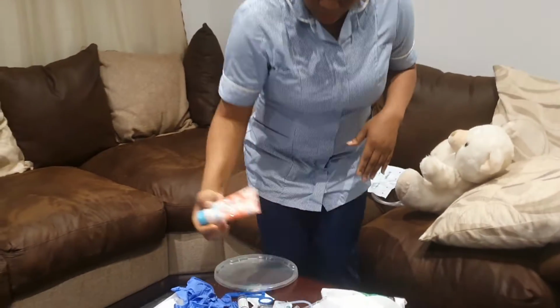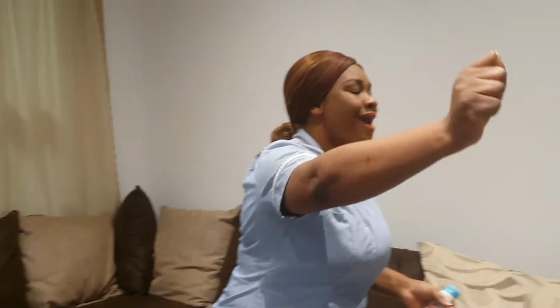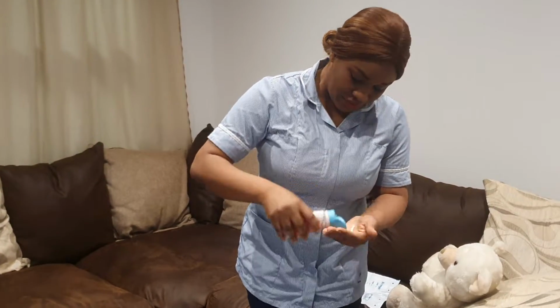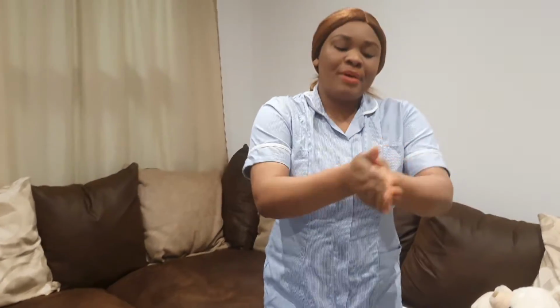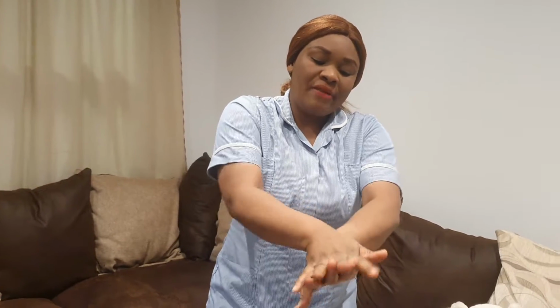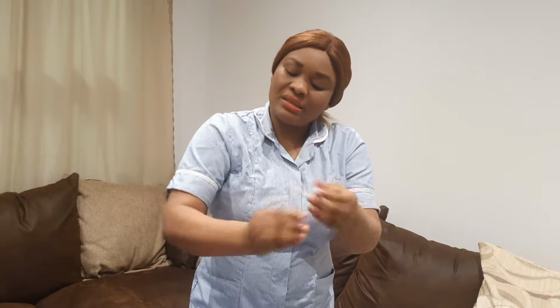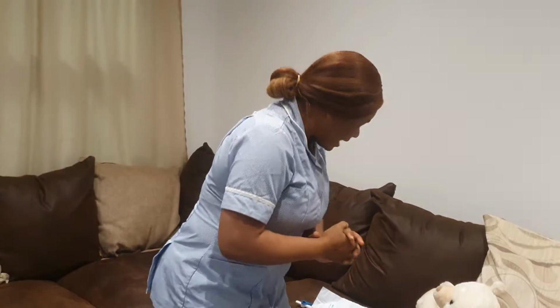All right, so I approach, my scene is safe to approach. I provide privacy for my patient, and I do my hand hygiene according to World Health Organization. Palm to palm, right palm over left dorsum, vice versa, fingers interlaced, fingers interlocked, rotation of the thumb, tips to the fingers, and the wrist. So my hands are clean. I can now proceed to my patient.